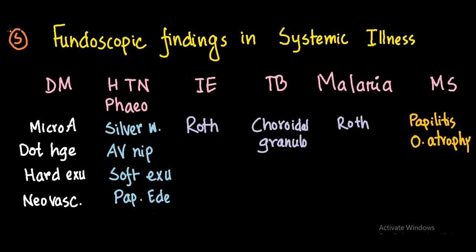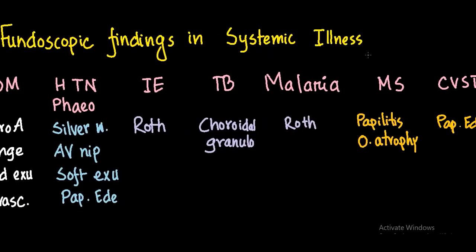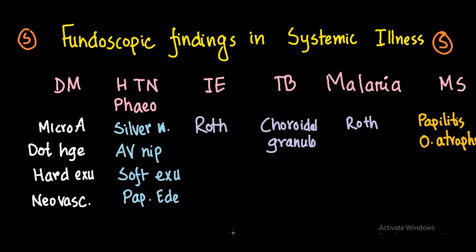So I have grouped most of the disorders that can be diagnosed with fundoscopy, starting with the classic ones, which are cardiorespiratory disease. I mean, not by default, but let's talk about the fundoscopic finding in different systemic illness, starting with the classic ones.